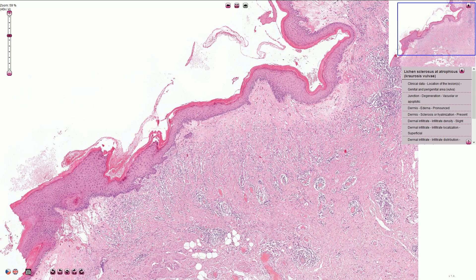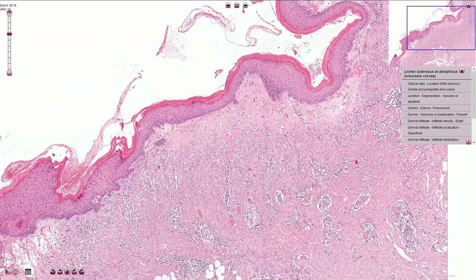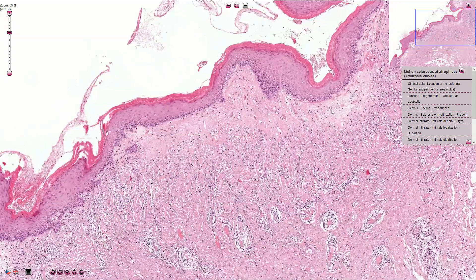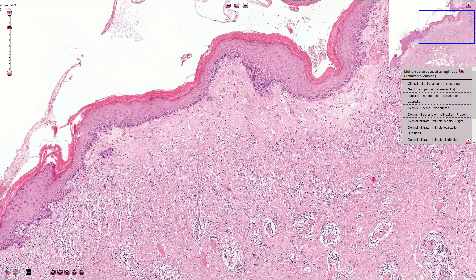In case of a well-developed lesion, we can see papillary dermal homogenization under the microscope. This is the hyalinized area in the superficial dermis — it is slightly edematous and lacks capillaries and adnexal structures.